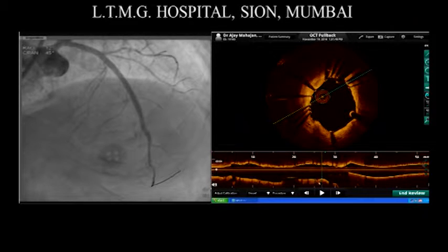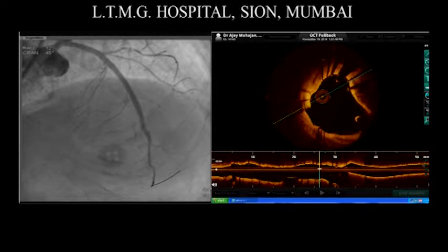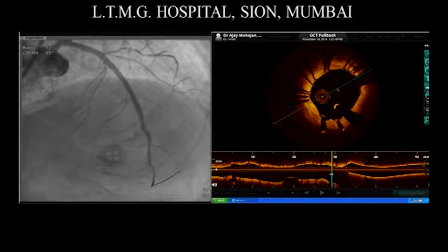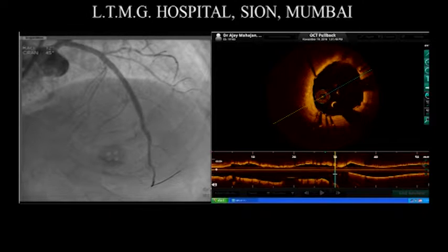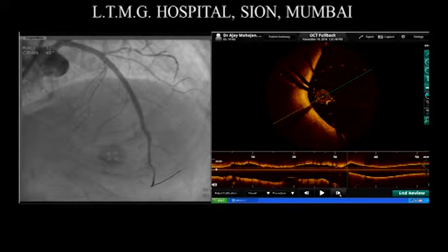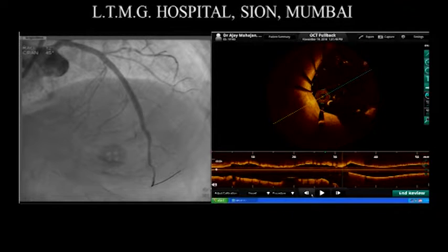This side. Go this side. Near 30, near 30. Come close. Go back. Go towards 40, slowly. This is the aorta. Yeah, that's aorta. I think that's actually good. Go towards this side. Yeah, you can see it on longitudinal view. There is the beginning of aorta. Yes.